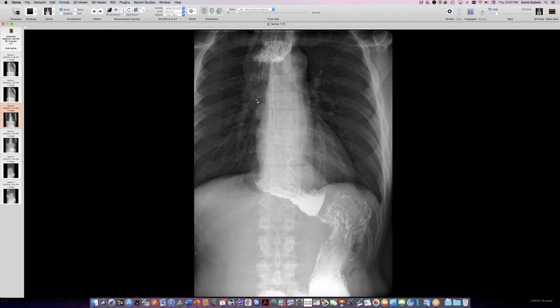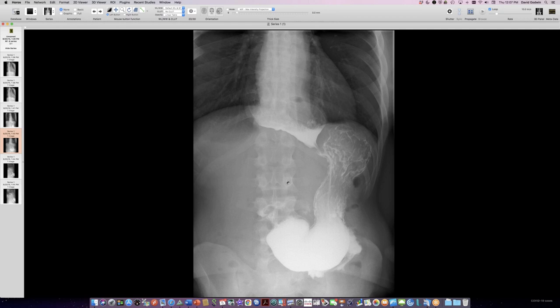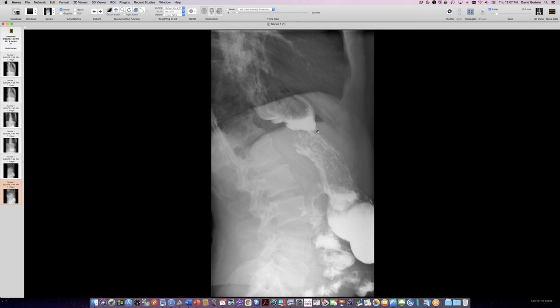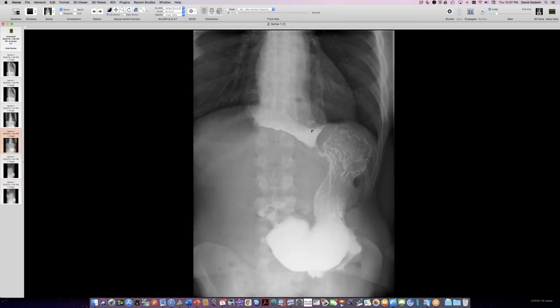So this very dilated esophagus looks initially normal, I think, because the contrast just streams down a few of the rugae or the striations in the esophagus and gets all the way down here. The lower aspect, we do have a pretty good beak on the esophagus there. There's no evidence of a mass causing obstruction. So a dramatic presentation of achalasia in a trauma patient, very abnormal chest radiograph, but not because of trauma.